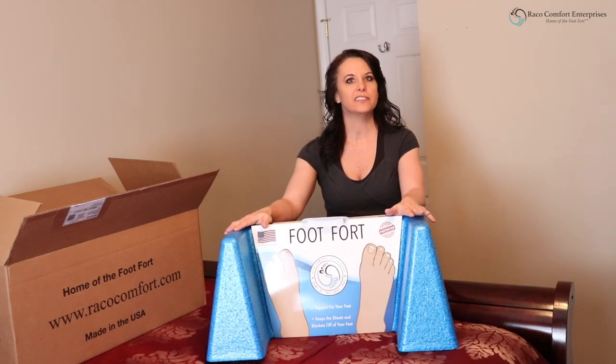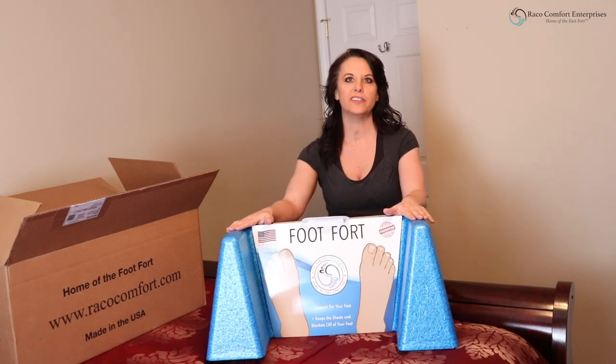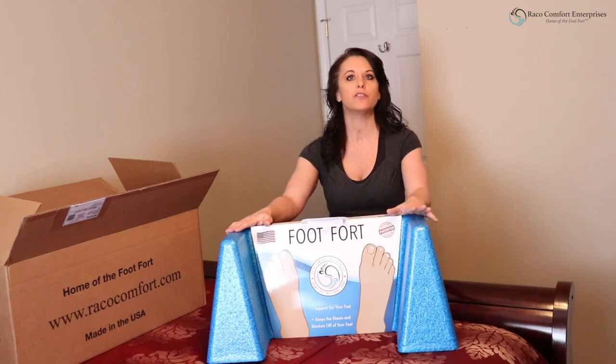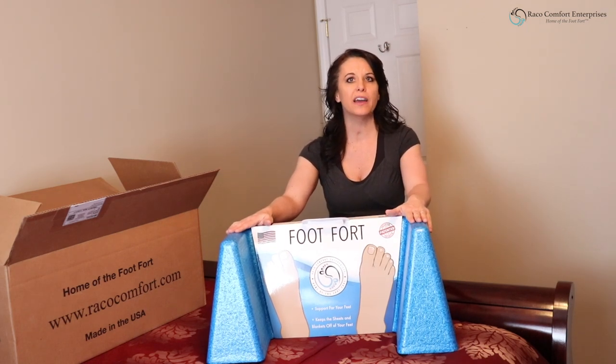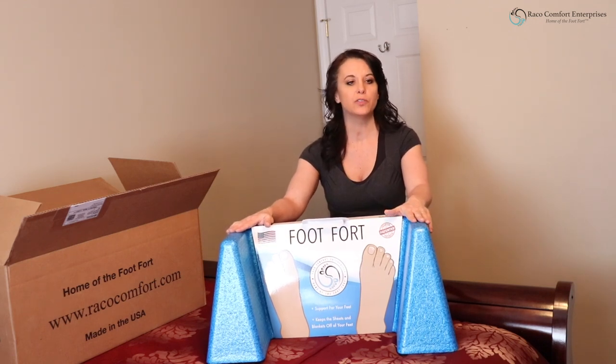It's the only product that's known to help stretch your feet and keep the blankets off your feet at the same time. It helps to increase airflow by keeping the blankets off your feet for people with nerve issues. It also helps you be comfortable when you're sleeping on your back, and it helps to increase blood flow by stretching the calves and keeping the blood vessels open.